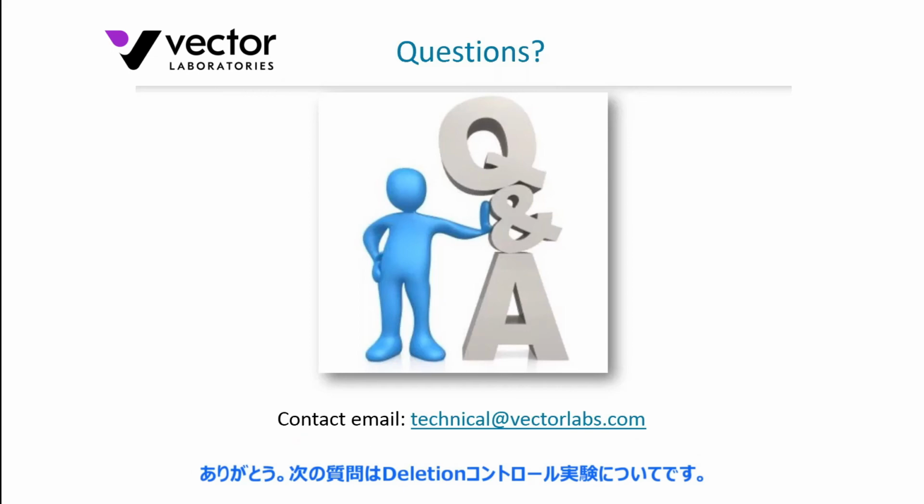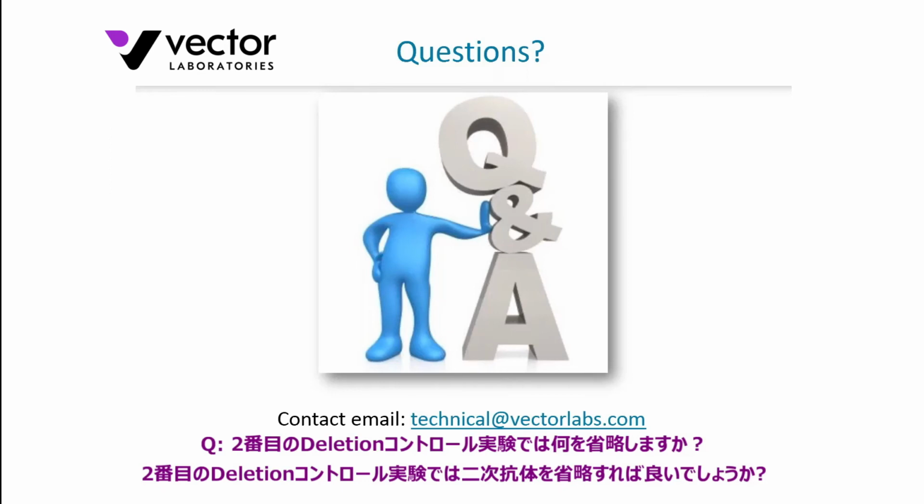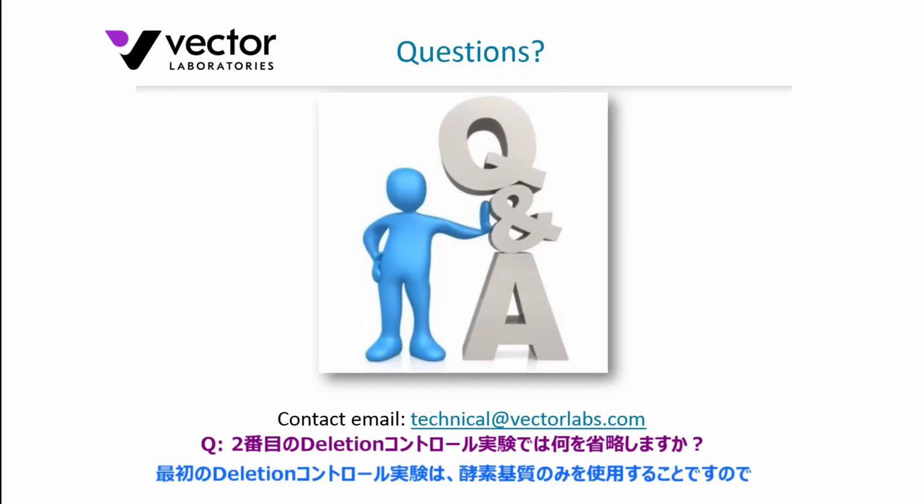Thank you. The next question is about deletion controls. What are you deleting with the second control? I thought the first was deleting the primary antibody, and the second deletion is deleting the secondary antibody. Right, so with the schematic we have, I had the primary, the secondary, and of course the enzyme substrate. So the first deletion control would be to apply just the enzyme substrate, and what we're deleting is the primary and the secondary in the schematic that I presented.